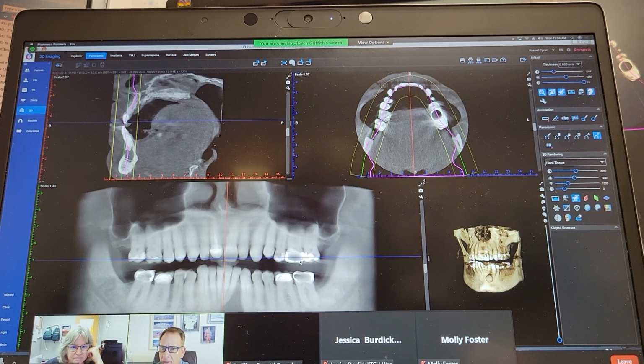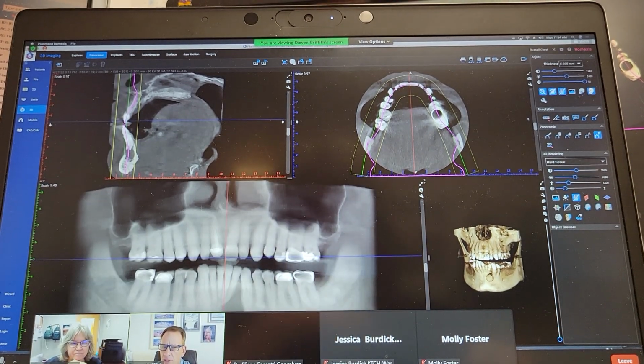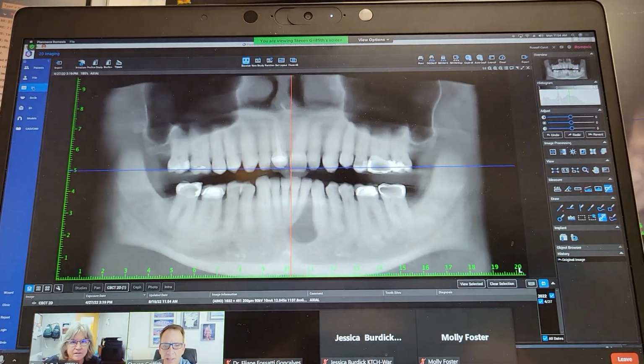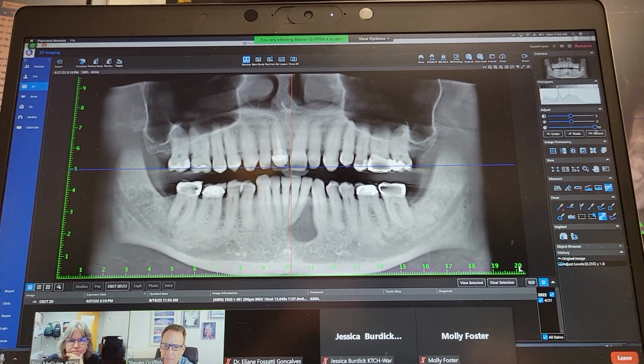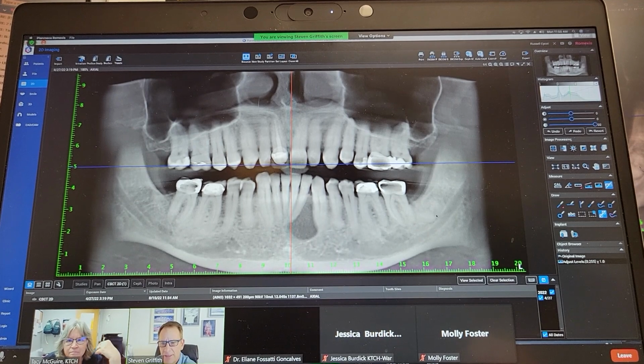That's it. So how do I do it? Well, click the camera. You just turned it into a JPEG. Come up to the upper left-hand corner, hit 2D. Now let's sharpen it just to make everybody happy, even though the insurance company probably doesn't know what they're looking at, right? Now look at that tooth back here that I just noticed. Look at this back here.